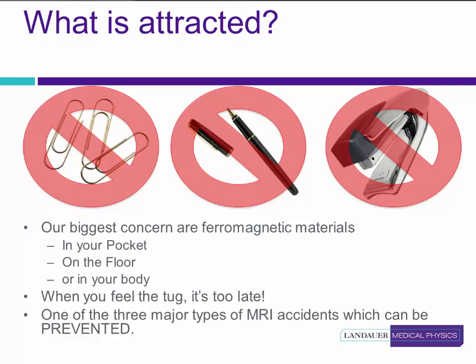While an artificial joint has never been removed from a patient by an MRI system, stents and other devices have been known to torque and cause significant damage and possible surgery to repair the damage. Of all the major accidents uncovered during a review of the FDA's reporting system, more than 90% were found to be preventable. We're now going to cover some important things to remember to leave out of the suite or talk to the MRI technologist about before entering the magnet room.